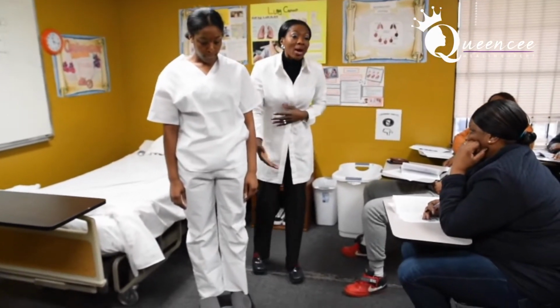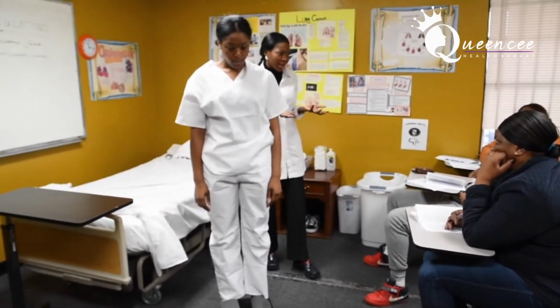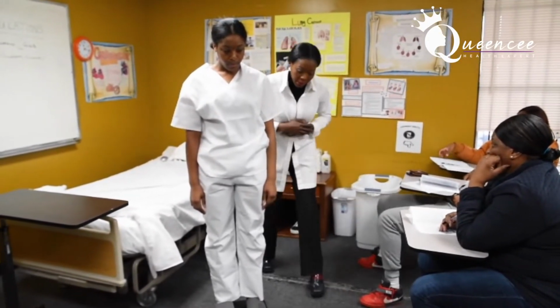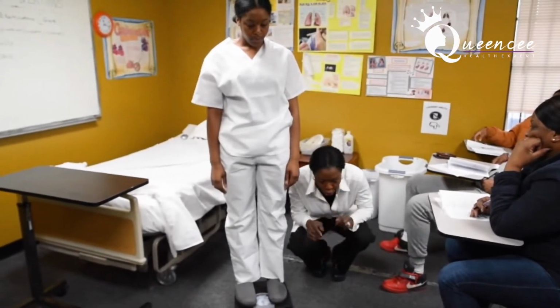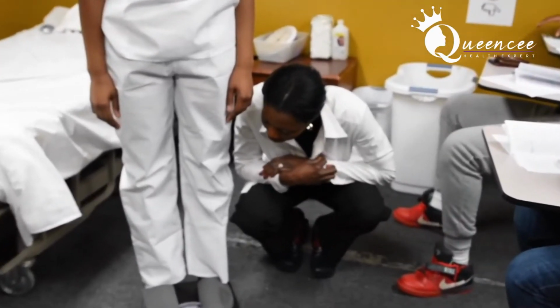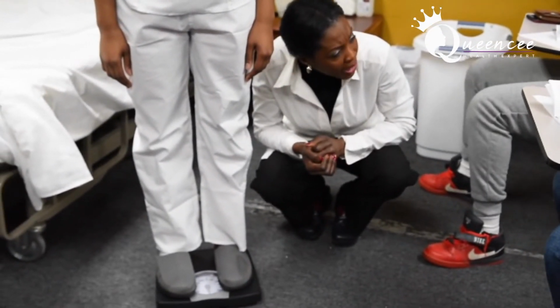If you do not squat so you can see clearly what your client's weight is, do we have a problem? Yes. If it's off, unfortunately, we will not make it. So you squat. Even if we have knee problems, you have to bend down over here, and then I keep the results in my mind.